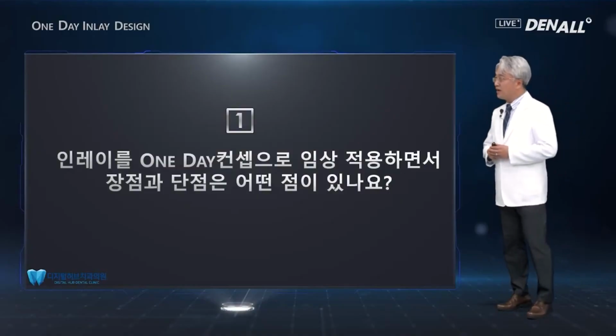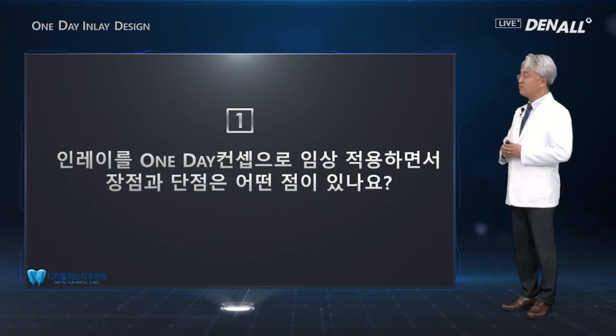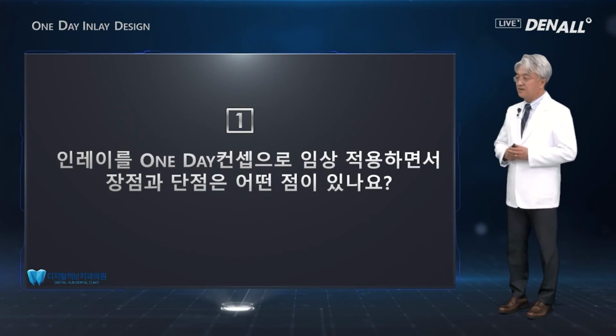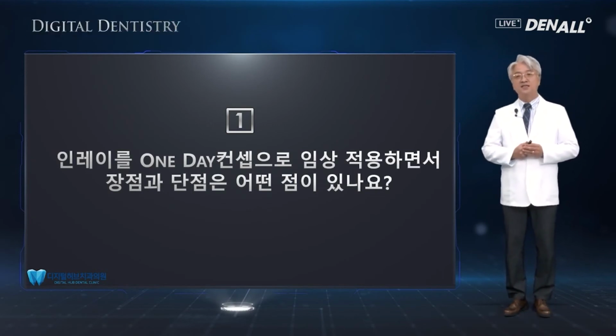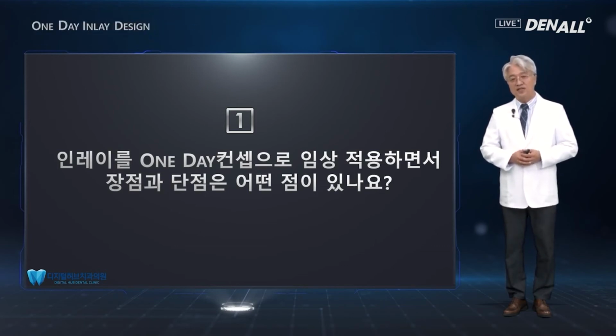First question: if you do the clinical one-day concept for inlay, what are the advantages and disadvantages? I think there are many more advantages than disadvantages in the one-day inlay concept. The biggest advantage is that everything can be finished within a day, with one visit. For the patient and also for the clinician, time-wise and financially, it's very attractive.